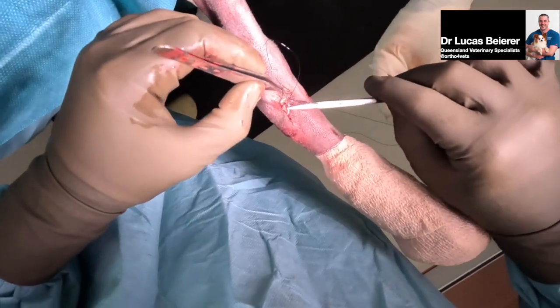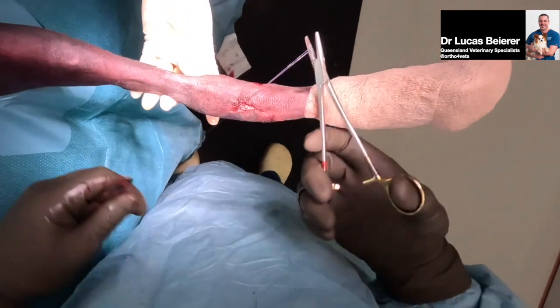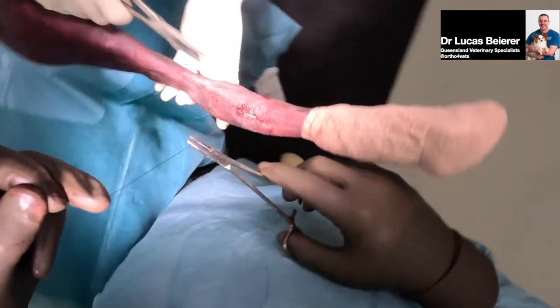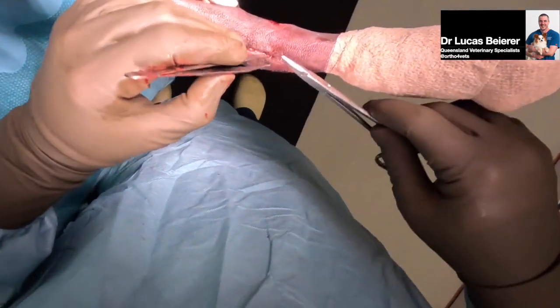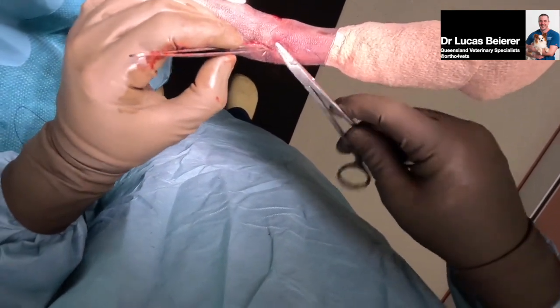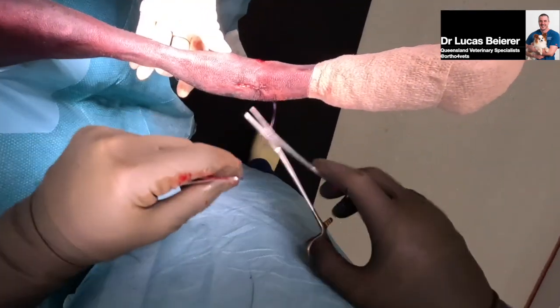So we definitely will dress this with a soft padded dressing for a few weeks, just while it swells, and hopefully we don't need to do a releasing incision. But we're far from the end of the surgery to know the decision on that yet. If it does need a releasing incision, then it changes the management quite dramatically. Sometimes just leaving it for 12 hours and reviewing the following day is the way to go, because what looks horrible to begin can look better, and vice versa.